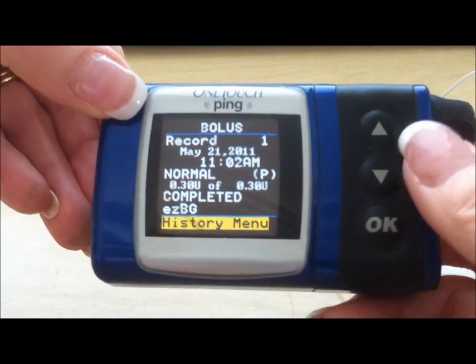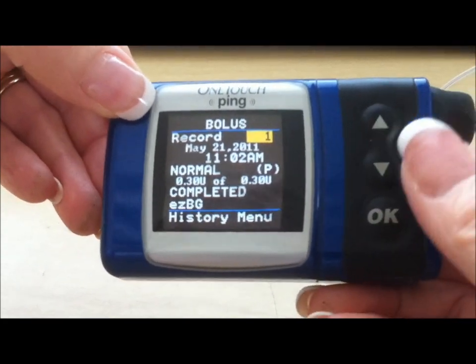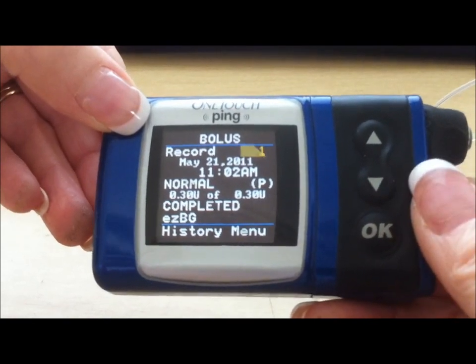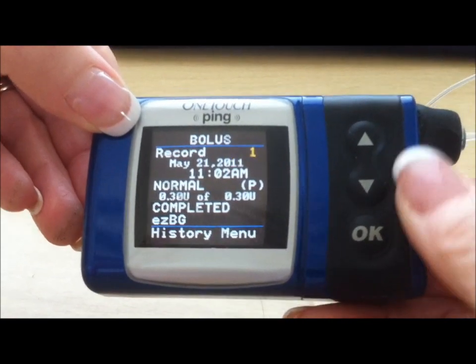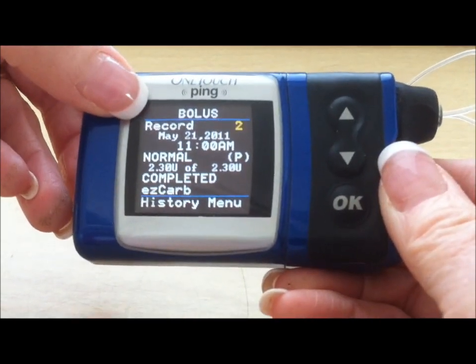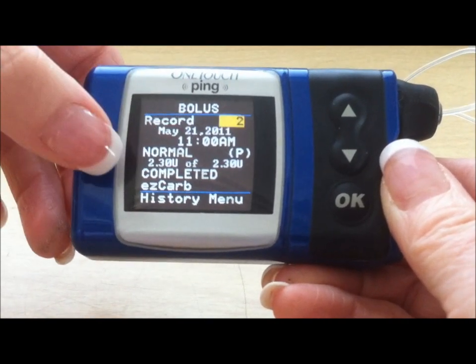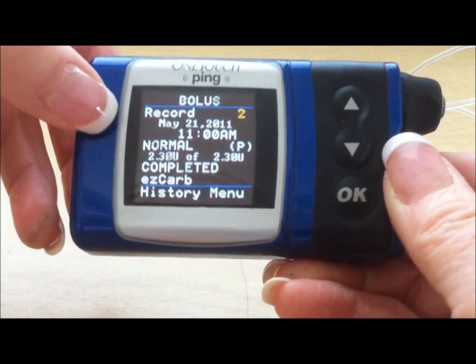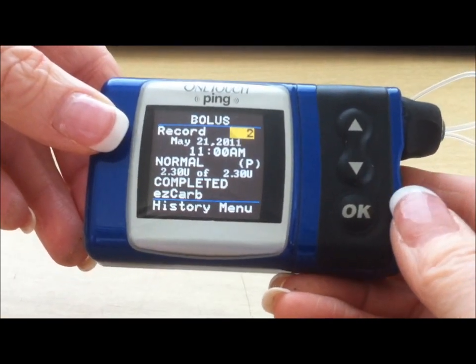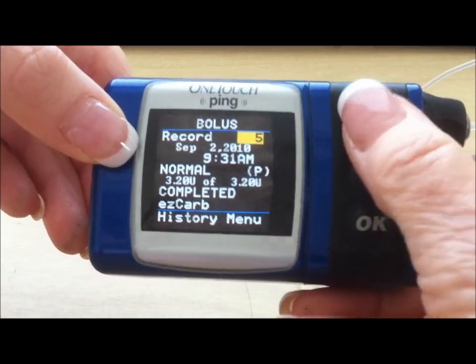If you want to go to the last record, from the history menu use your up arrow to highlight number one because that was the last record. Press OK — that's blinking, meaning you can change it. Press your up arrow. The second record was at 11 a.m., 2.3 of 2.3, and that was an EZ carb — so this was a bolus given in relation to food that was consumed. You can continue to go back; it will hold several hundred readings.